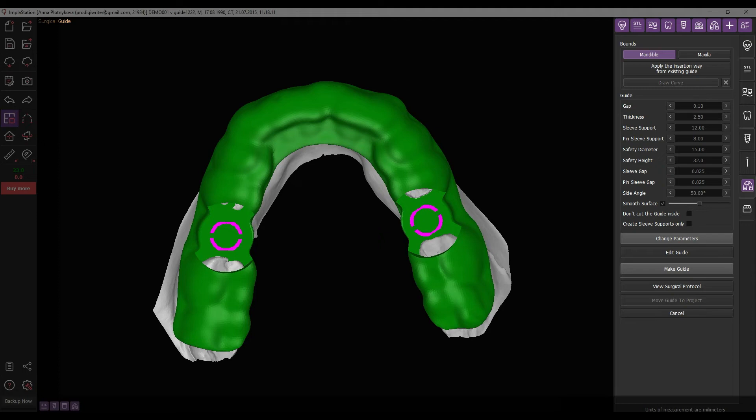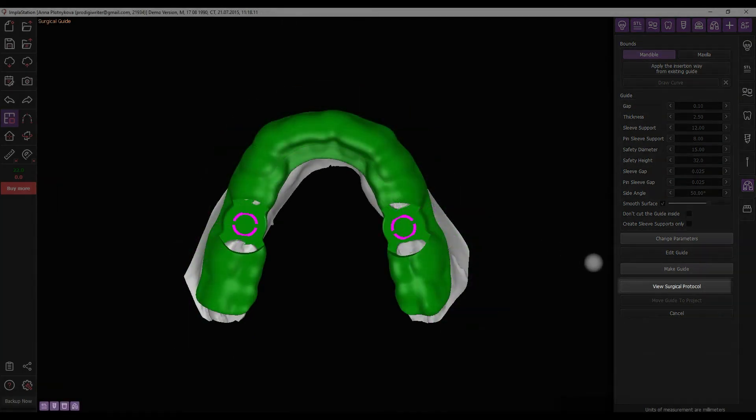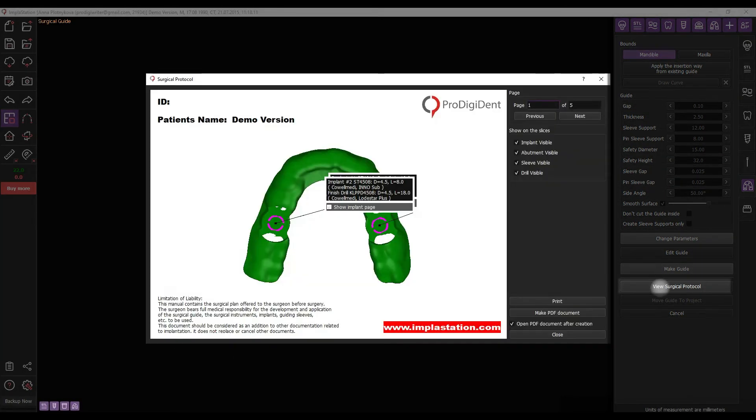Additionally, access to viewing the drilling protocol becomes available through a special button.